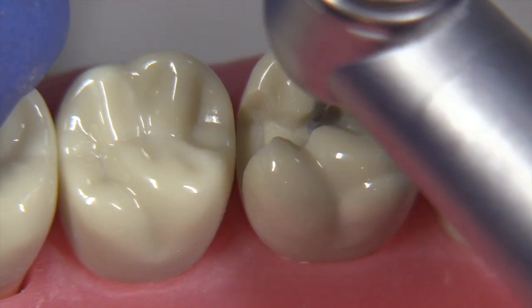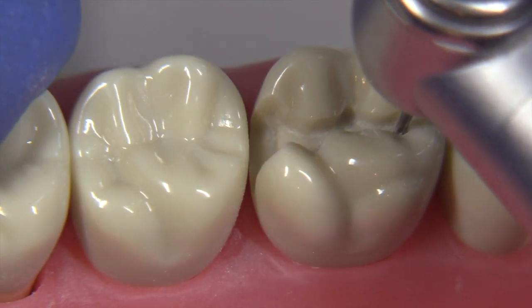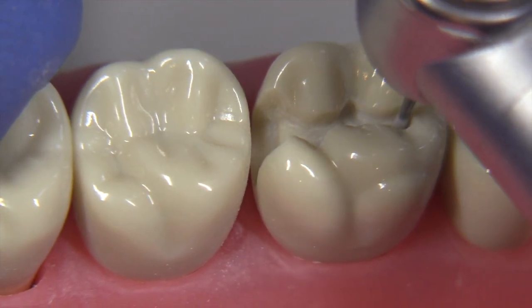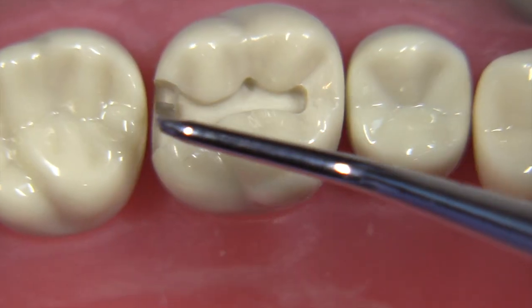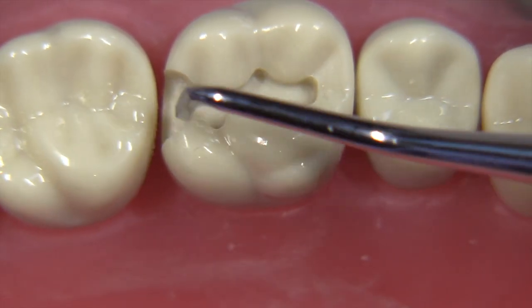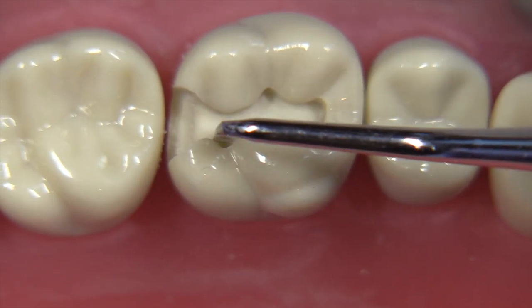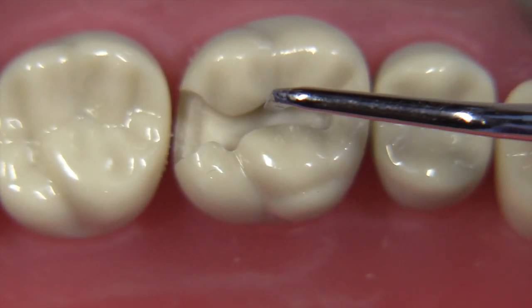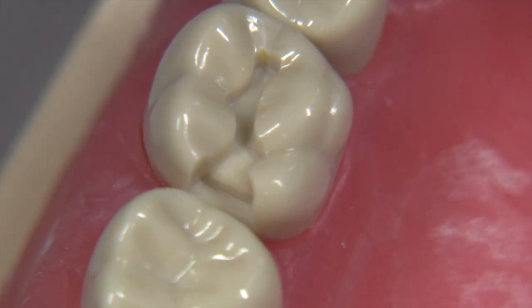Always see something to refine just a little bit more. You could use a stall-out high speed or maybe a slow speed just to make sure you've got everything crisp and smooth internally - take another two or three minutes to do that. One of the things you really want to make sure you do is clean up the preparation of all debris, blow out all the debris. You could use a mild cleaner with a brush or toothbrush if provided. You can use the chisel to remove any little bumps you might see.